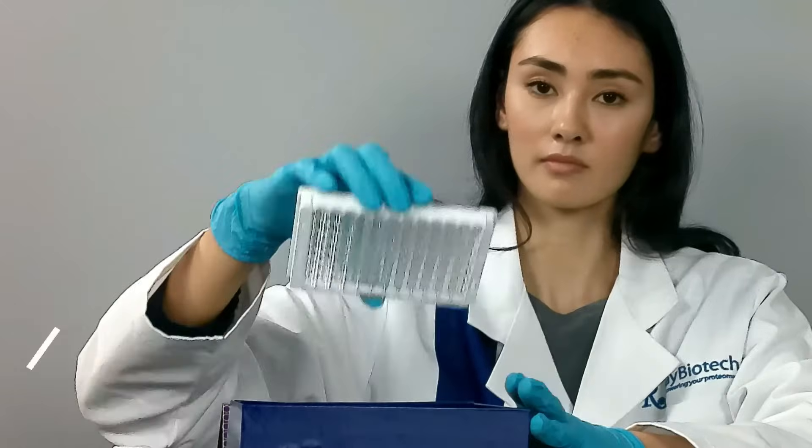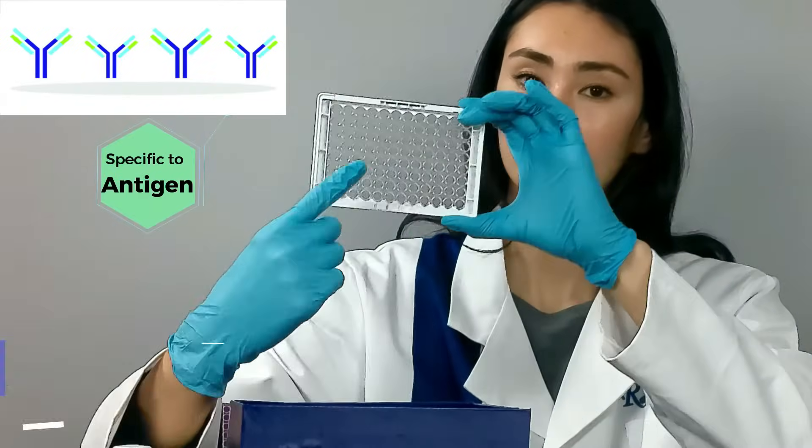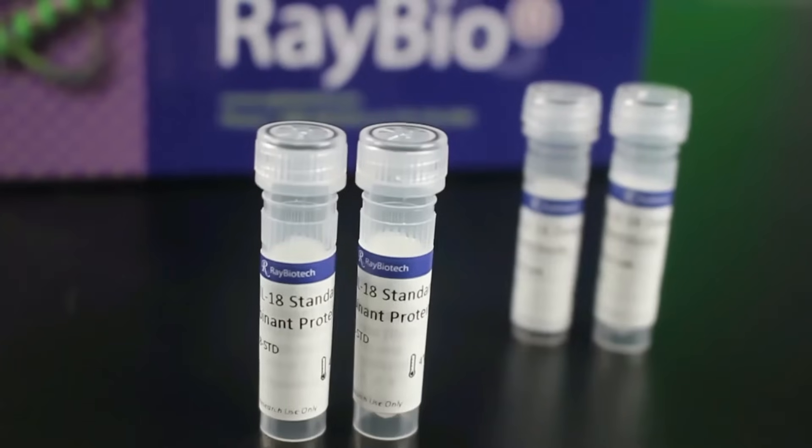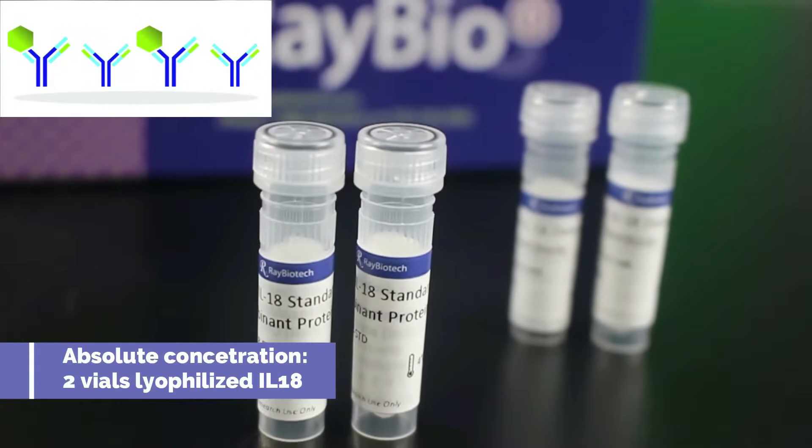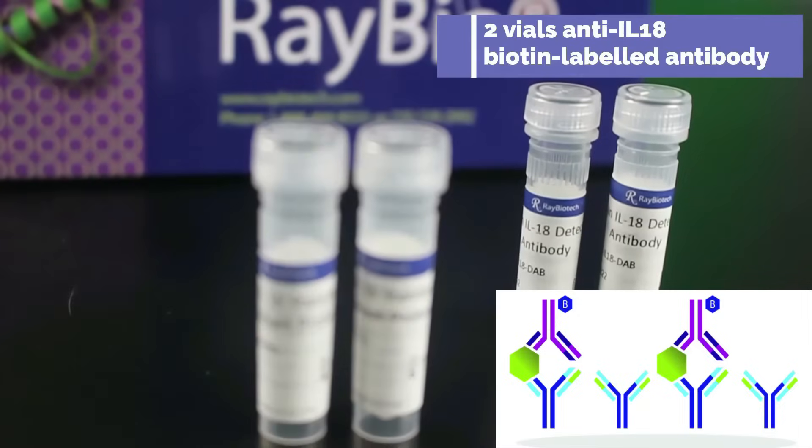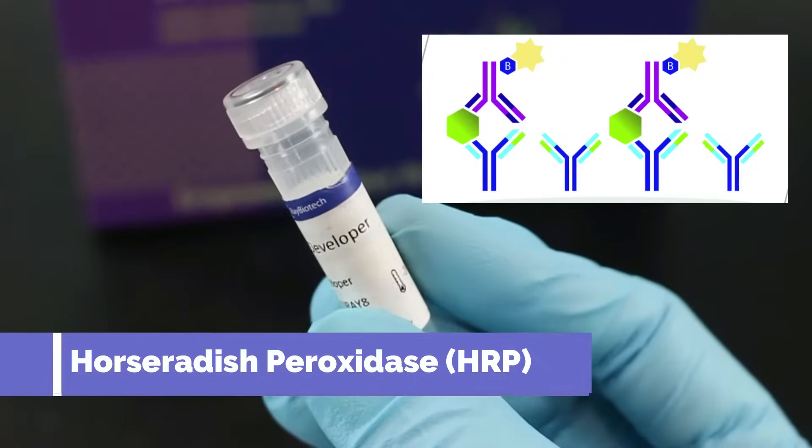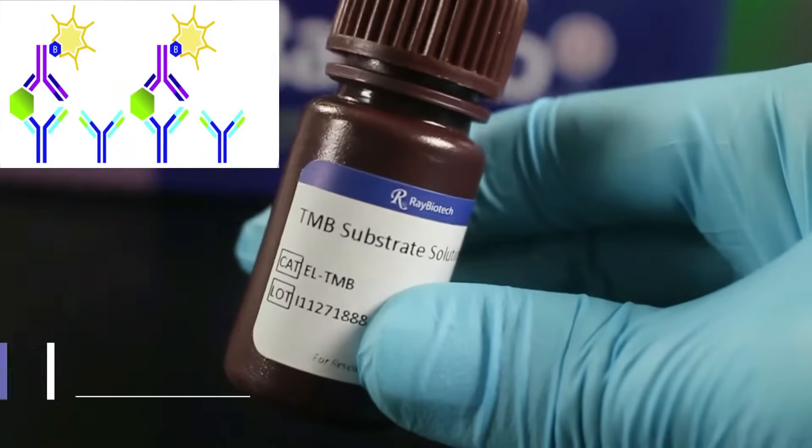First is a 96-well ELISA plate pre-coated with anti-IL-18 antibody. We are quantifying the absolute concentration so we have two lyophilized standard vials of IL-18 and two vials of anti-IL-18 biotin-labeled antibody. Detection enzyme is horseradish peroxidase, commonly known as HRP. HRP is paired with light-sensitive substrate, TMB.